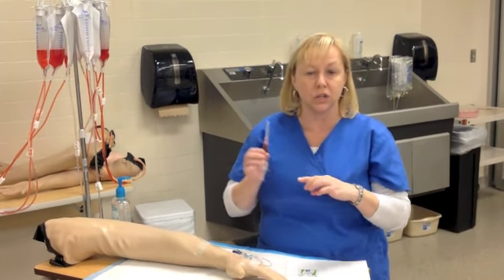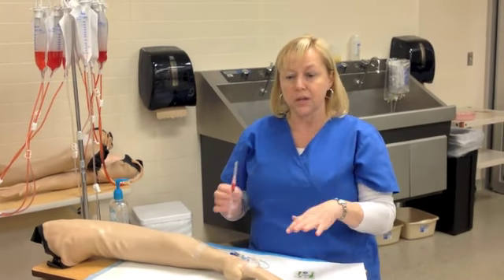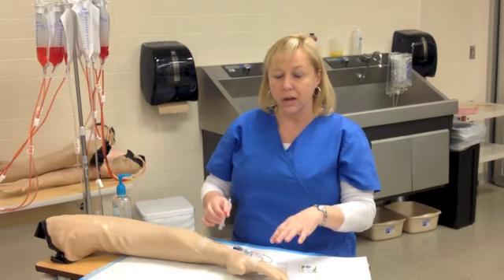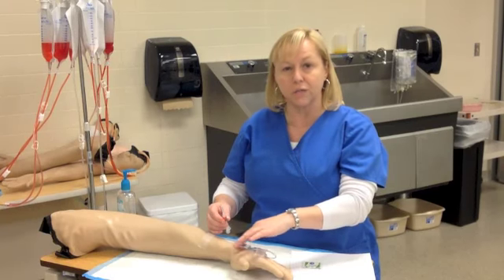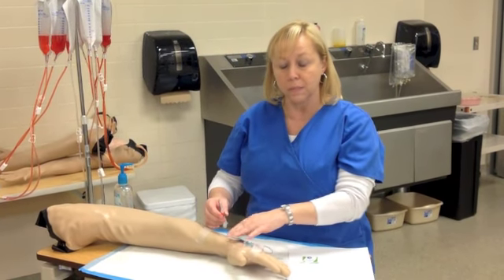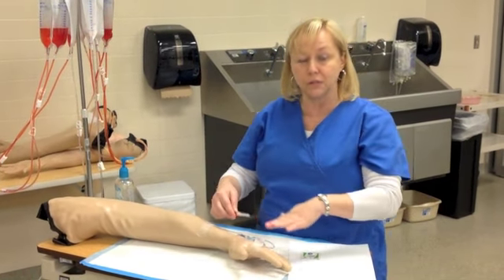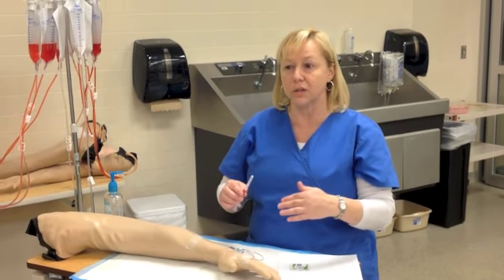I've put red medication in this syringe so you can see what happens with the medicine as it runs. If the patient did not have an IV that was running and they had like a saline lock in place, then you would need to flush it to check for patency of the IV before, and then you would need to push the medication and then flush behind it to flush the medication out of the tubing. If it's running, you don't have to do that.